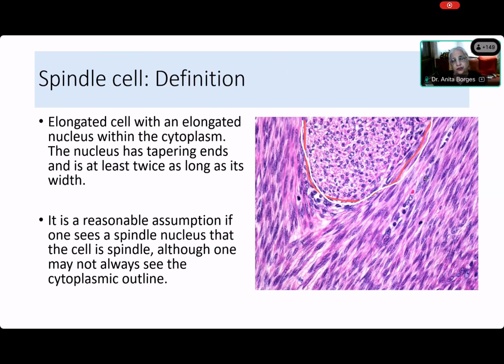You can see the definition of the spindle cell is right there. So, is it a spindle cell or not? You don't think it's a spindle cell. All right, let us ask Aditi.